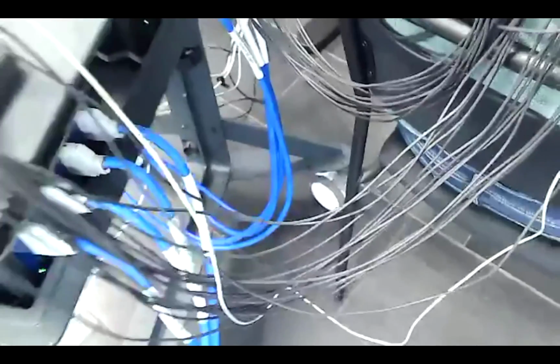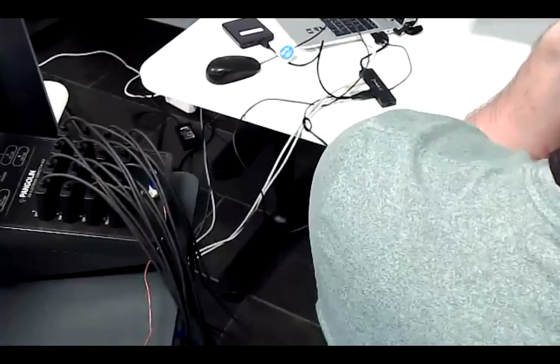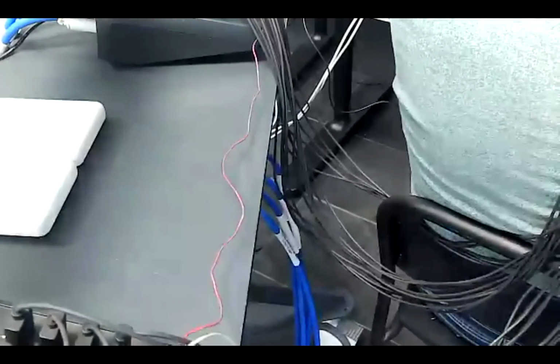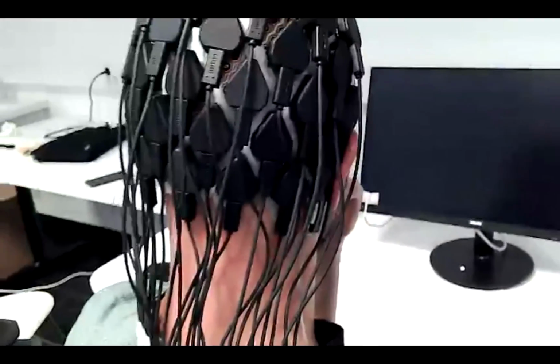And we use two high amps, so you can see two high amps, two connector boxes, and a battery that powers our connector boxes. The red cable is in this case the shared ground that we need for both of the amplifiers. And the grounding in general is this cable that we mount here.